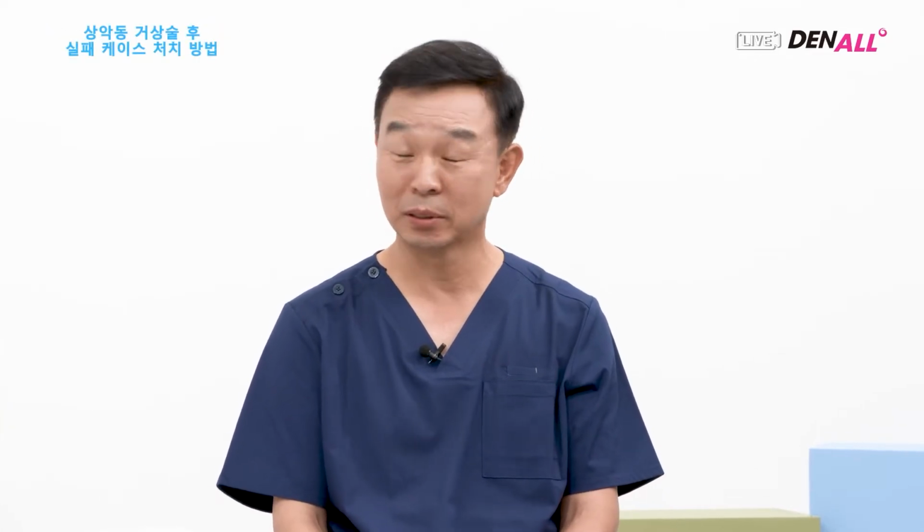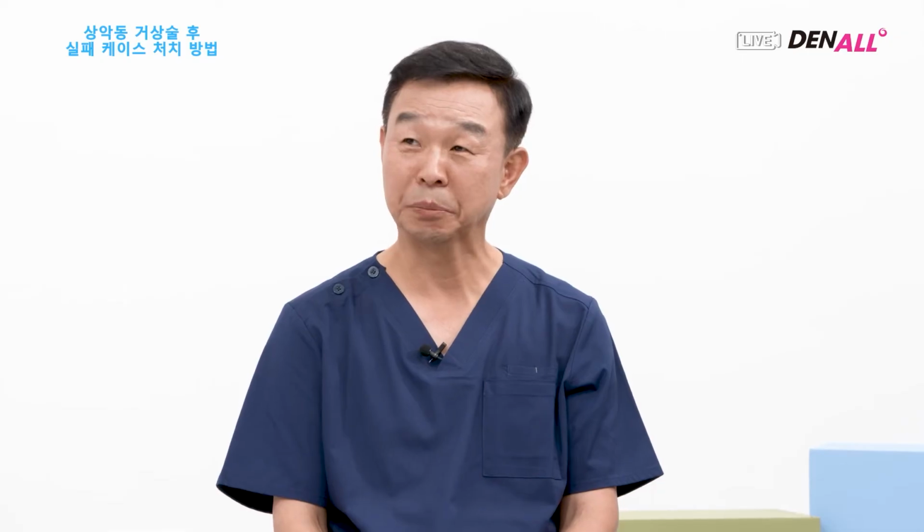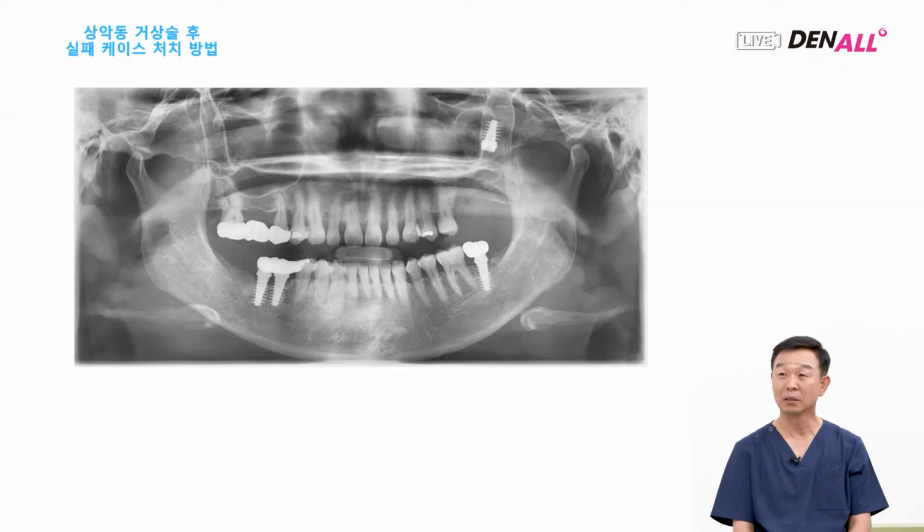There are broadly two ways to remove the fixture. The most frequent approach would be through the external wall of the sinus. The second approach is used a lot in otorhinolaryngology using an endoscope. Mostly, the lateral window approach can be used to remove it.